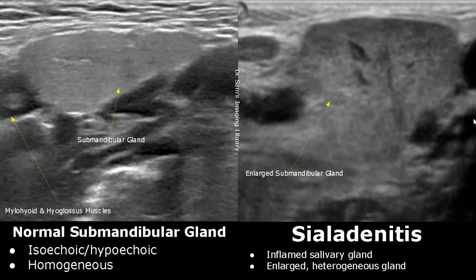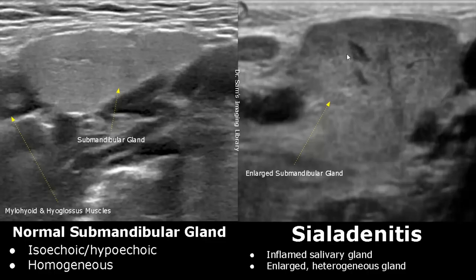Sialadenitis is the inflammation of salivary glands. In this image, the submandibular gland is affected. We can see an enlarged, heterogeneous submandibular gland.